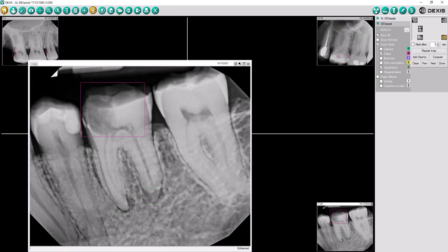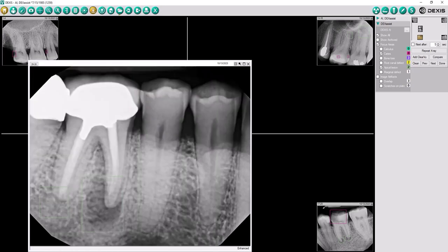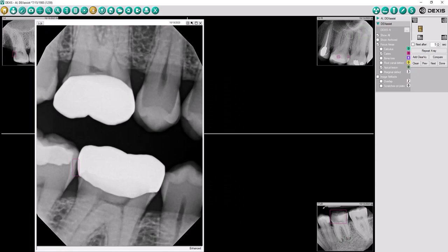If you disagree with a finding, simply middle-click with your mouse to hide it. If at any point you wish to bring the finding back, re-click your desired finding to view it again.